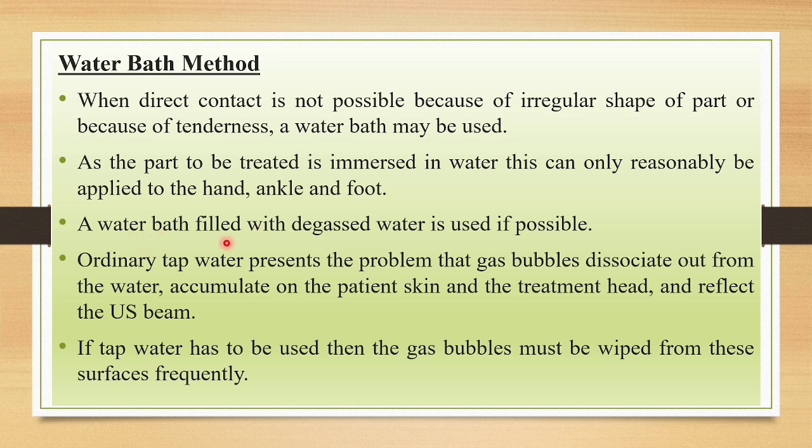A water bath filled with degassed water is used if possible. Ordinary tap water presents the problem that gas bubbles dissociate out from the water, accumulate on the patient's skin and the treatment head, and reflect back the ultrasound beams.